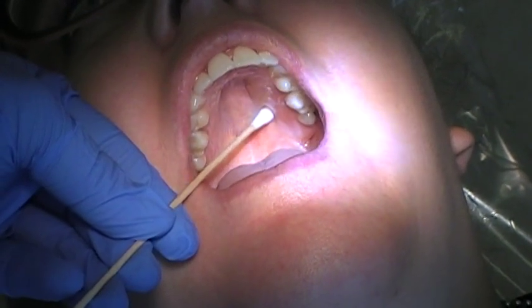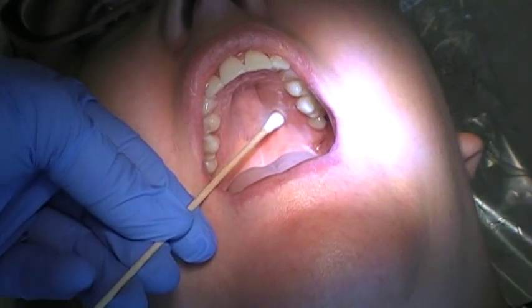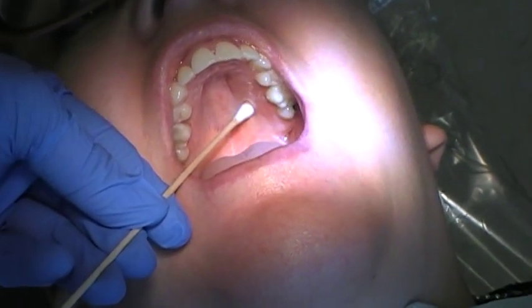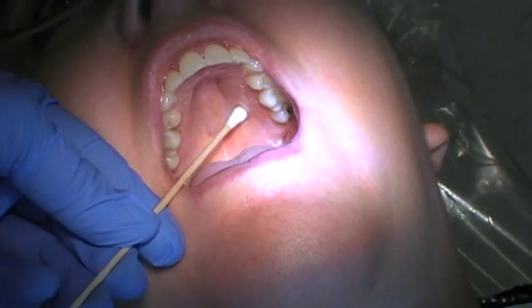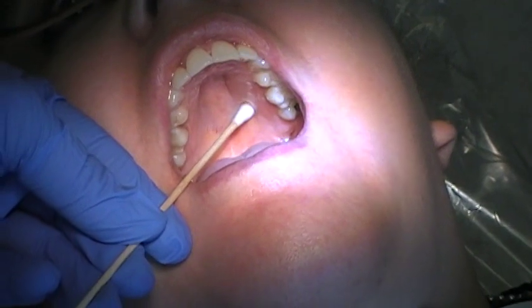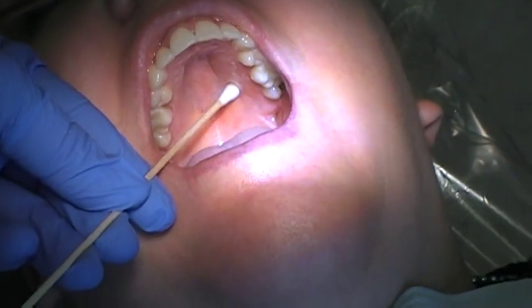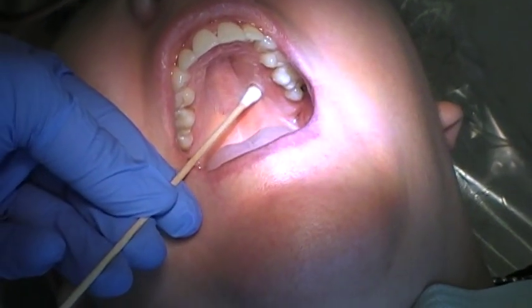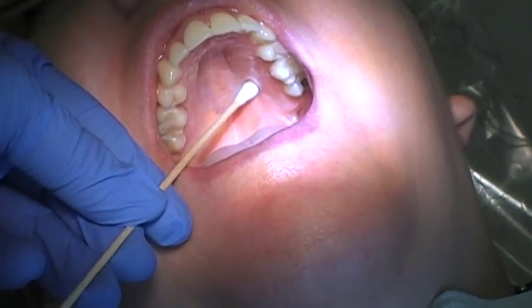Remember, the structures that the GP block is going to anesthetize are the periosteum and the tissue on all the posterior teeth — premolars and molars. The landmarks are the vertical and horizontal planes of the palate, the second molar, and the purple or gray springy spot.